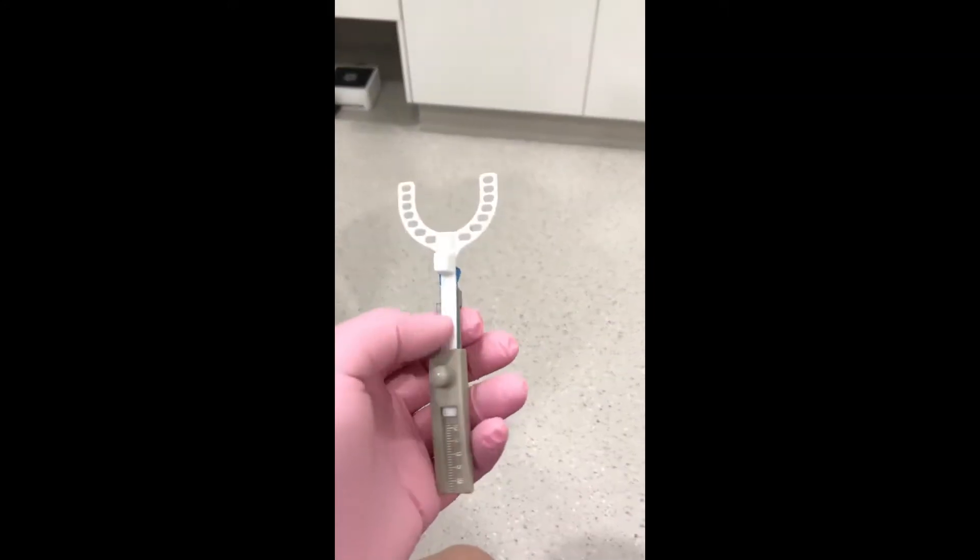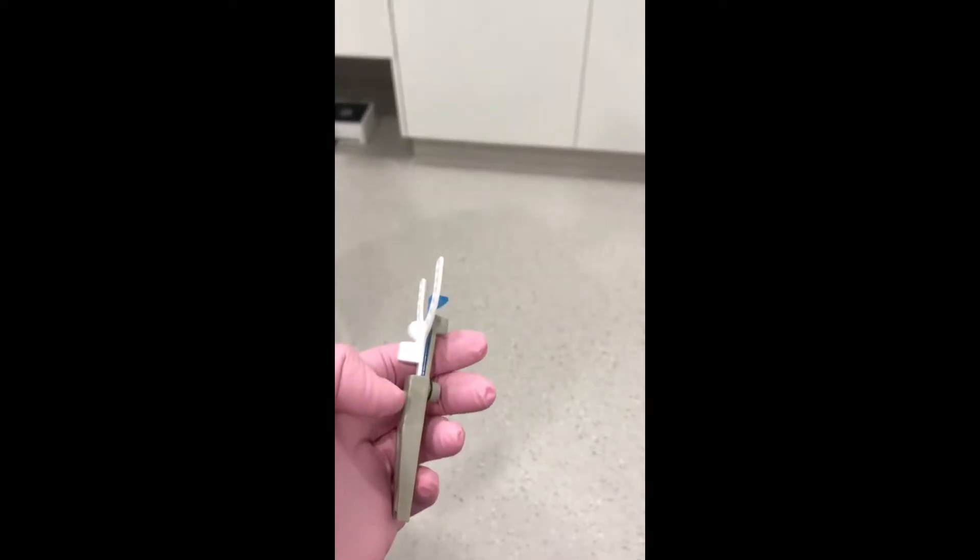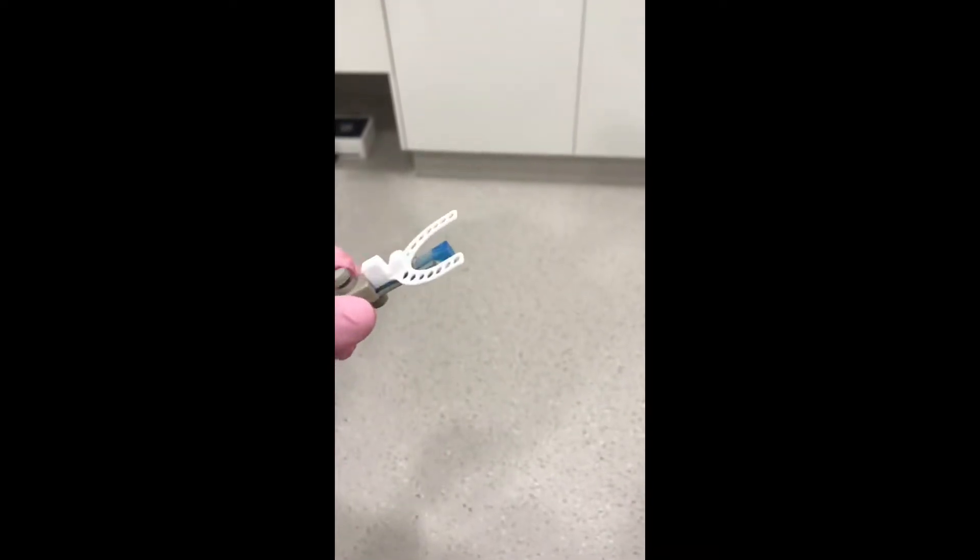After that, insert the bite fork into the body of the gauge and slide it until the indicator end is at the zero point on the millimeter scale. Lightly tighten the upper turn screw.